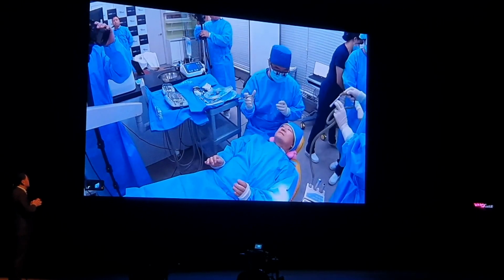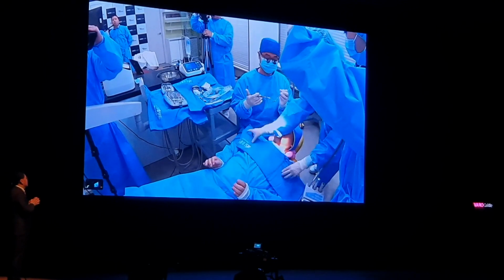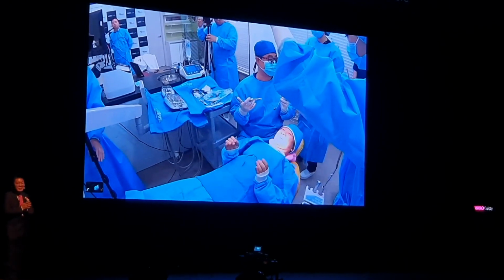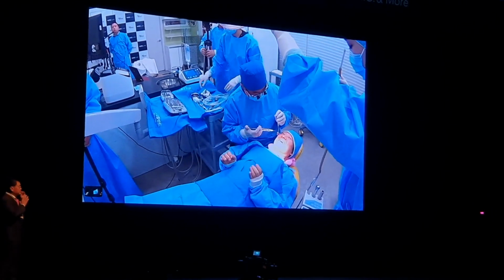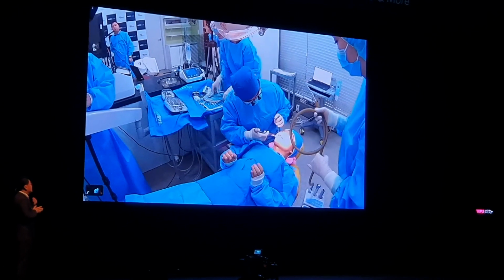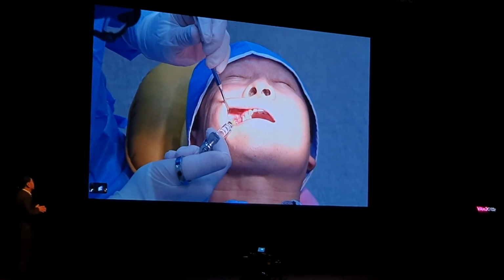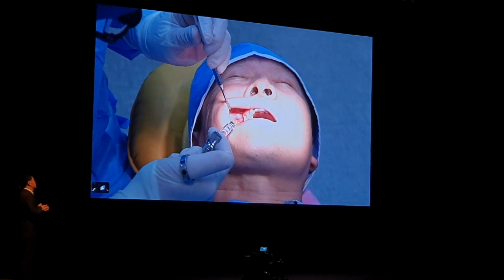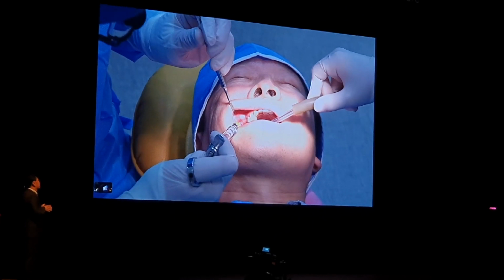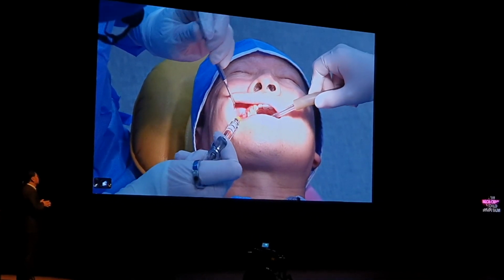Dr. Kim is now delivering local anesthesia. I'm preparing for local anesthesia. The patient just asked me to make it less painful. Yeah, he sounds so desperate. Everybody feels nervous when undergoing anesthesia. Dr. He is no exception. Hang in there. Do you feel pain? Are you okay? They're currently delivering local anesthesia.